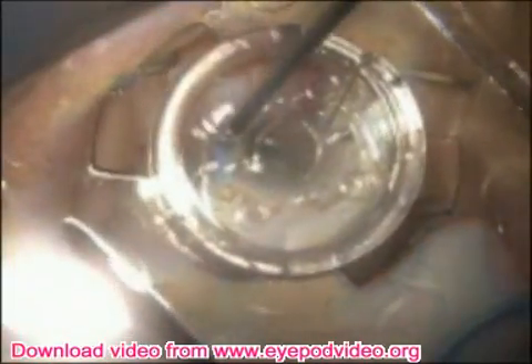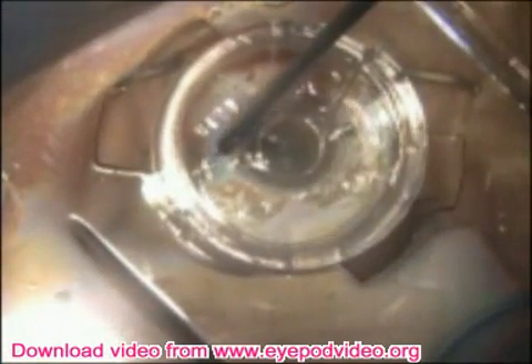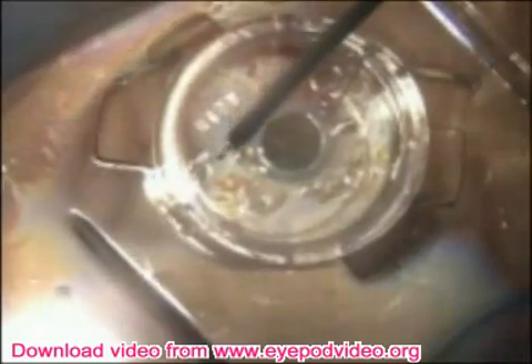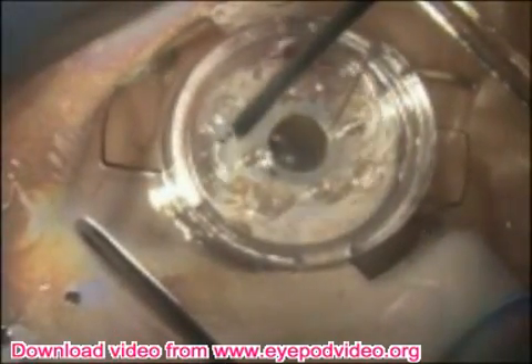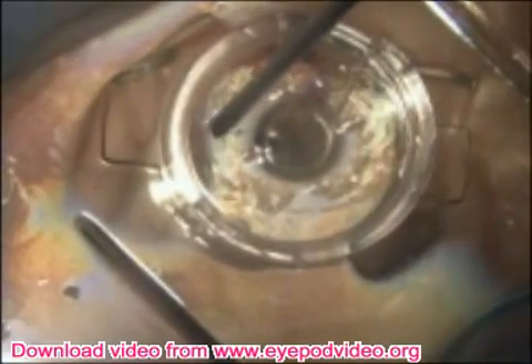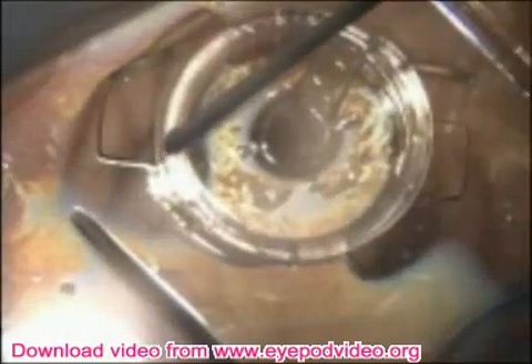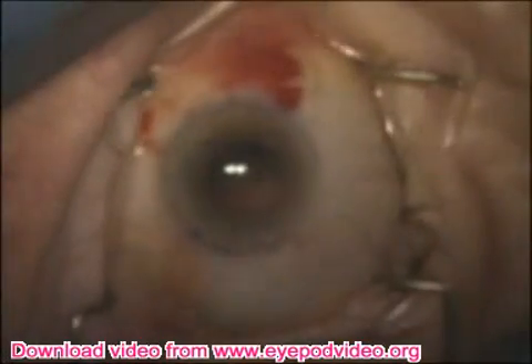Here we're loading an Optitec capsular tension ring. You can see this small hook which is at the end of the cylinder. The hook is placed into the eyelet at the end of the capsular tension ring, and then the plunger is released and a spring mechanism pulls the hook back so that the eyelet and the capsular tension ring are pulled into the cylinder.